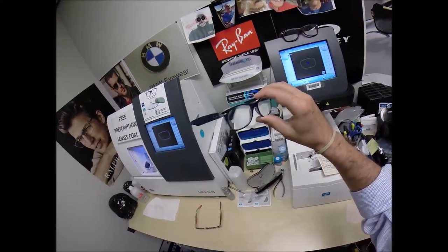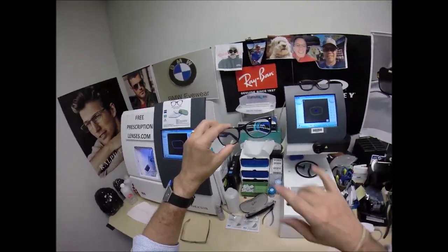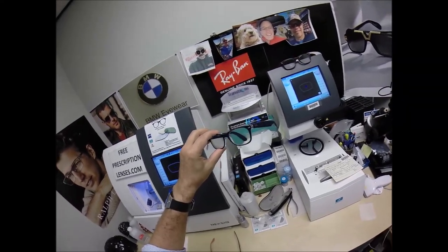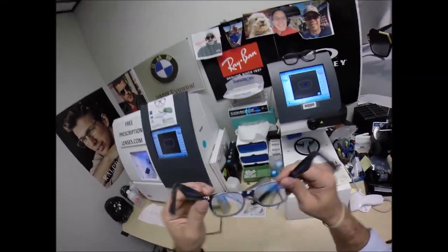For those of you keeping score at home, I'm wearing the Ray-Ban 2132 New Wayfarer, the sunglasses. I took out the dark lenses and I put in my prescription transitions lenses with anti-glare. So when I go outside, just like Jose's, they're going to turn dark and look like sunglasses. But all right, let me put mine back.